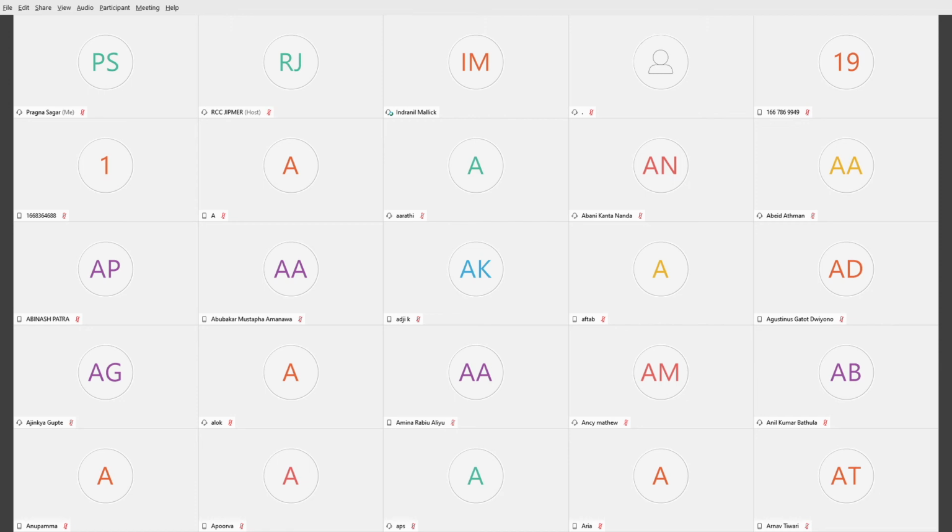That is what we do, although there are no guidelines, no real level 1 evidence and that kind of thing. So there we will do adjuvant radiotherapy, and we will cover the nodal volumes. Earlier we used to stop at L5S1. Now we go up to the bifurcation of the aorta. So we would cover the nodal volumes in node positive.